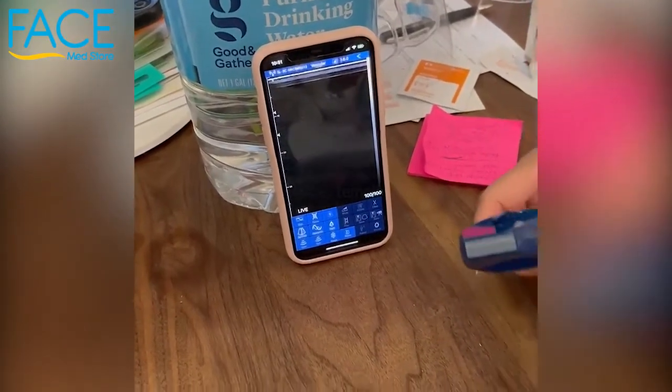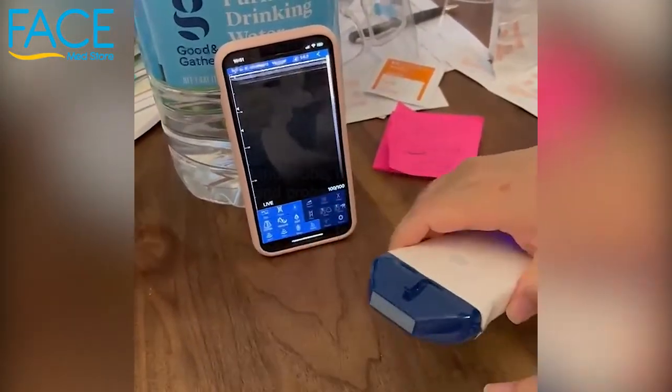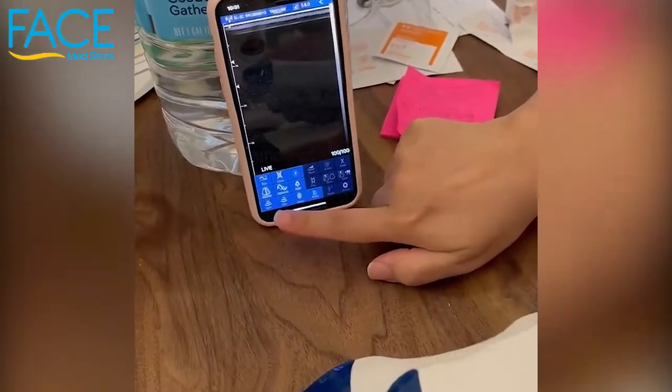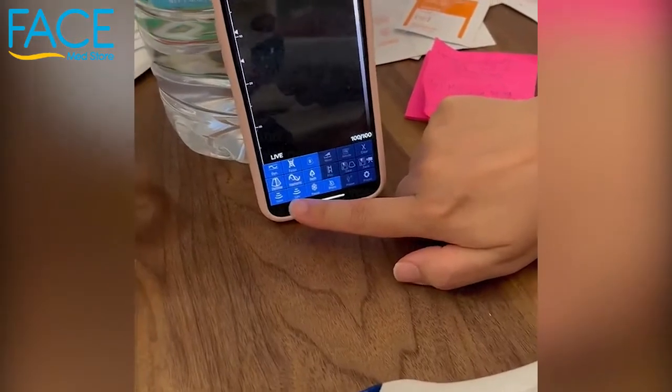We have a couple of different ultrasounds that we're using. As you can see, we're on the vascular one. We are live. You can also get Doppler on this as well — you just have to click on the color.